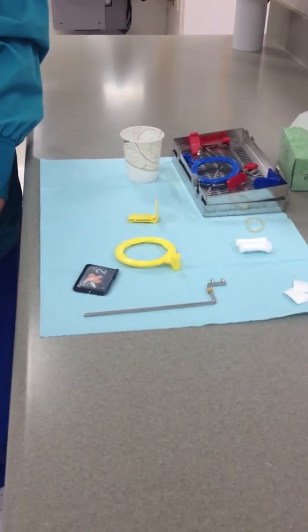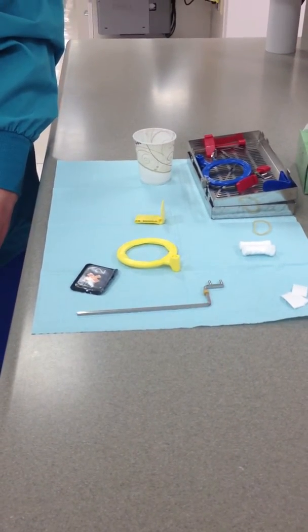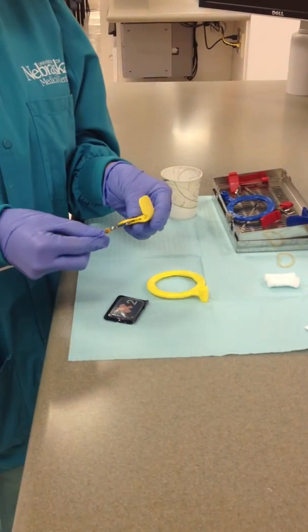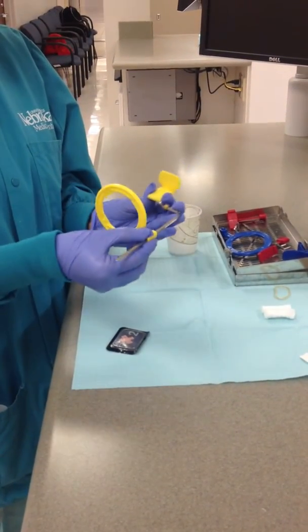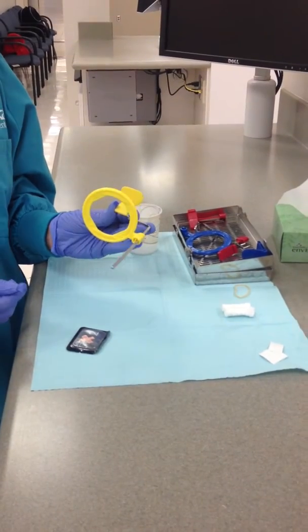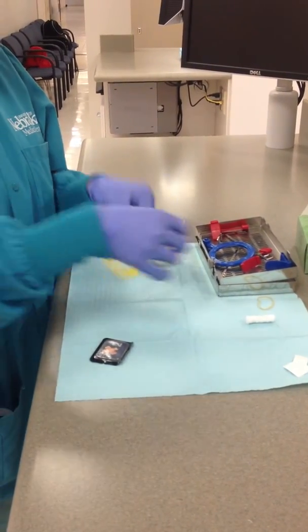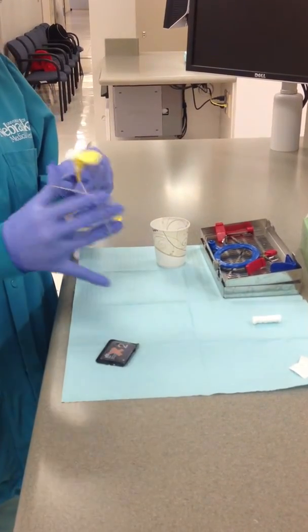A film holding device is usually used to position the film. The device has a bite block for the film and a ring which helps to align the beam. To start, glove up and assemble the XCP unit. The cotton roll is used for stability on the arch opposite the one being radiographed, and also for comfort for the patient when biting. They are secured with a rubber band to the bite block.